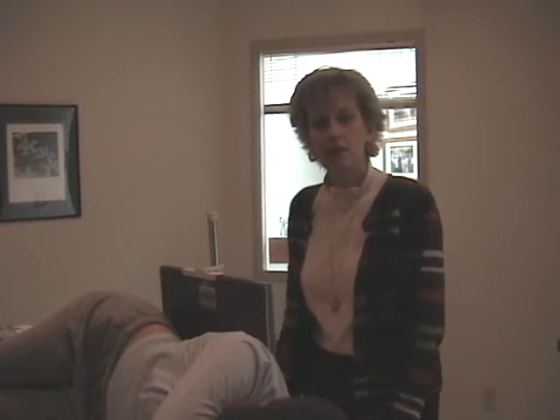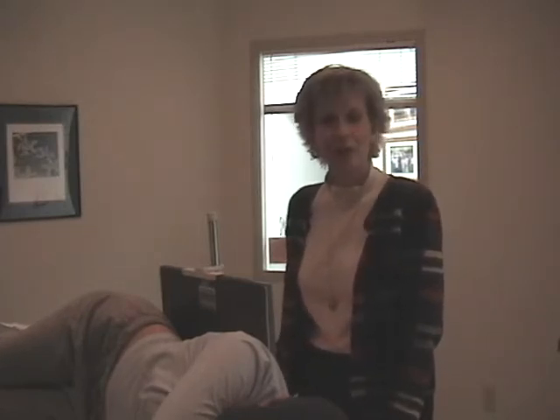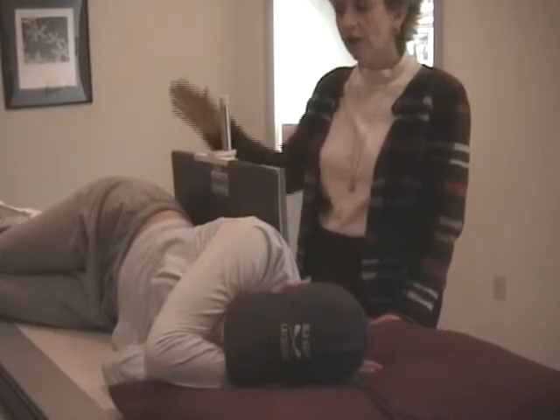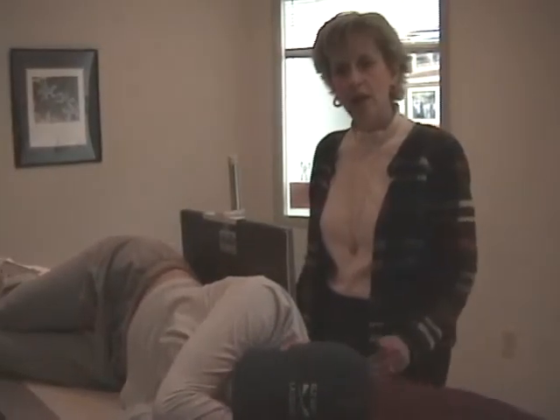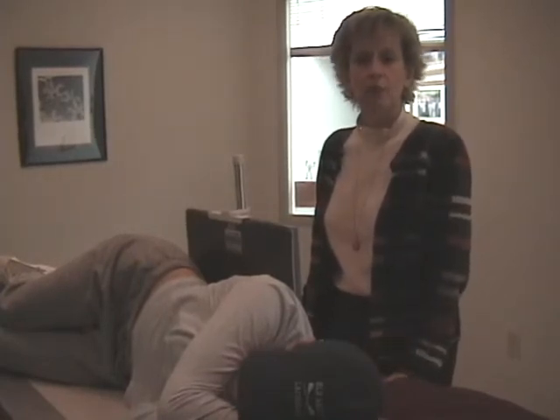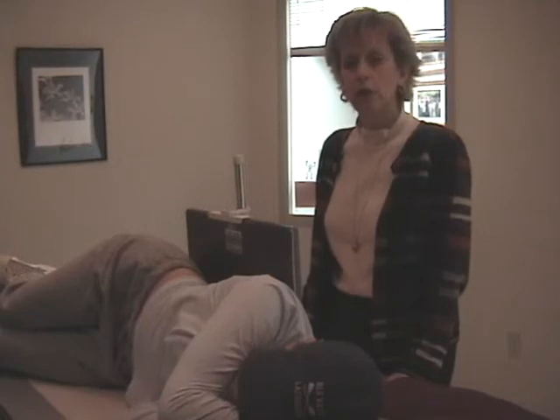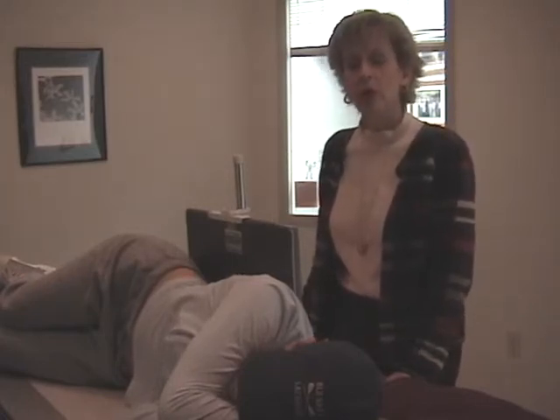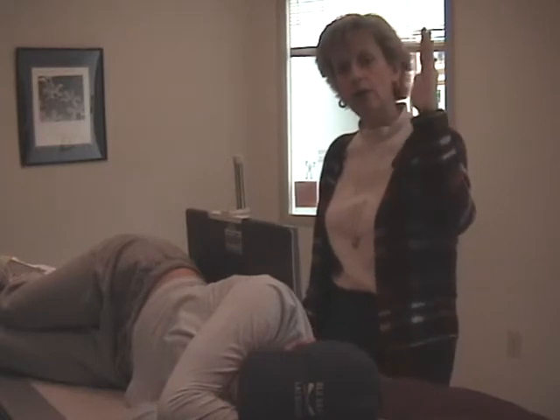Right after we made that exposure, I came back into the x-ray room and I asked my patient to turn on to their left side. Drea has been on her left side approximately 10 minutes while I got the rest of the equipment set up. I will have you recall the intro explanation in that when you're demonstrating air fluid levels, there needs to be a chance for those air fluid levels to settle down and to level out in the body. So the patient came to the department already in a vertical mode, and that's why we did the PA chest and the upright abdomen first.